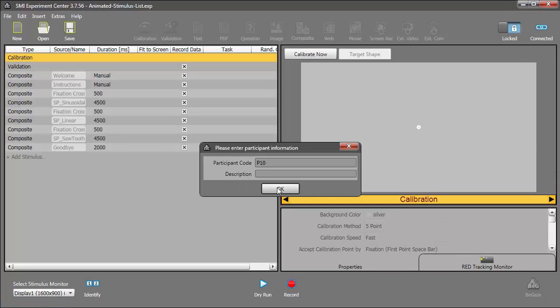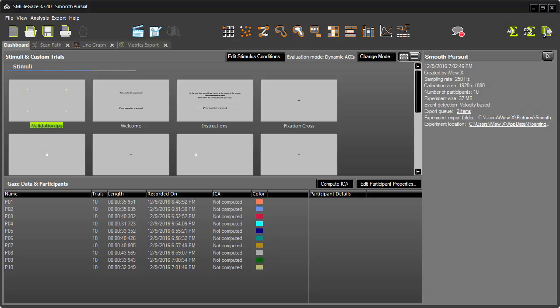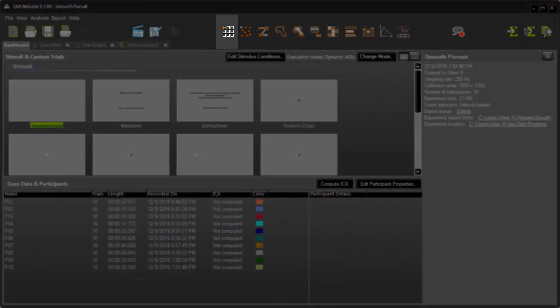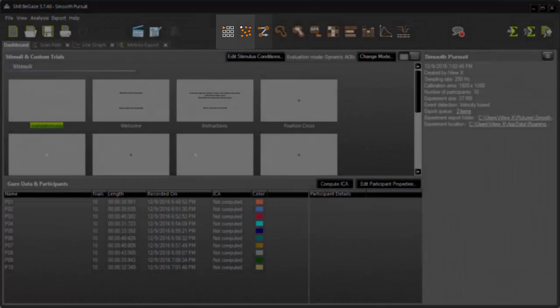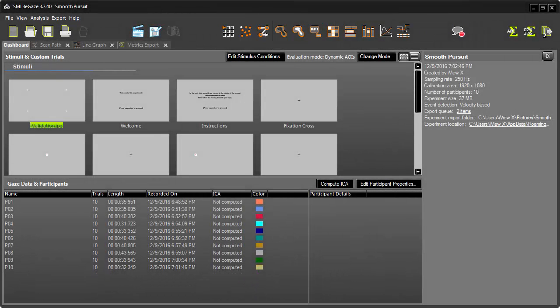After all my participants have completed the experiment, I just need to click BeGaze to analyze the data. Naturally, all the standard BeGaze data visualizations are available, such as Gaze Replay, Beeswarm, and ScanPath.